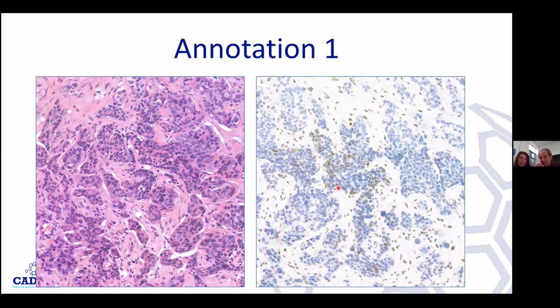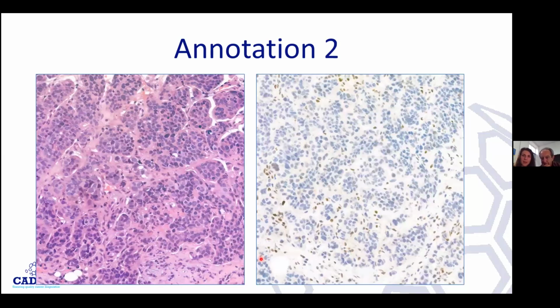Maybe, I would say that some of them, look at this one, for instance. This one is a little bit darker. But maybe it's because this slide has got heavy counterstaining, and therefore you look at a little bit of this bluish, brownish thing. But anyway, I take on board. Would you not consider this to be staining? Wild type? Yes, following your line of thought, I think this could be. It could have been two cells, and we should have said wild type. But this whole nodule only had internal control, and the tumor cells were actually negative.